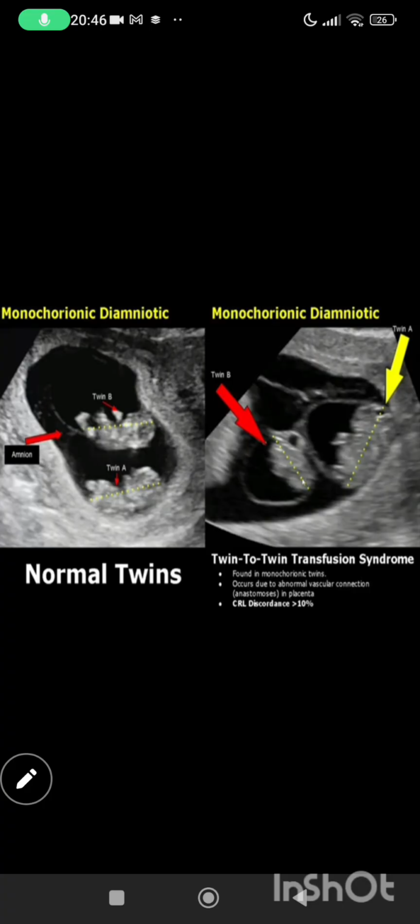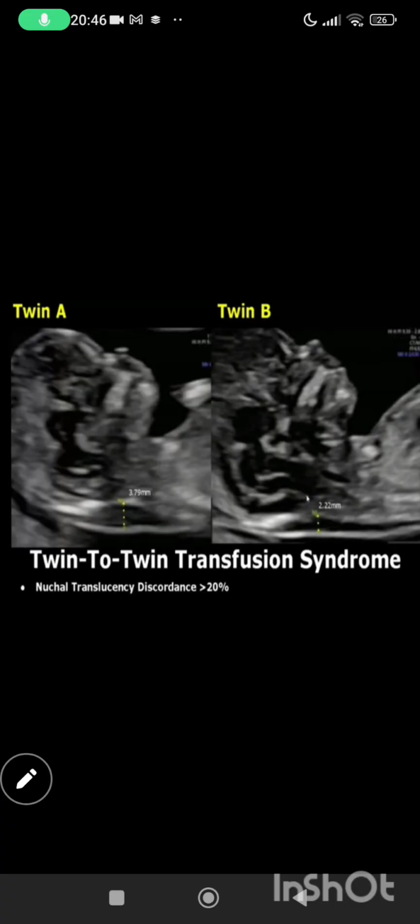And what happens in stage 5? One or both twins die. Yes. So death of one or both twins happens in stage 5. So that is their staging. Now we will see their images one by one.